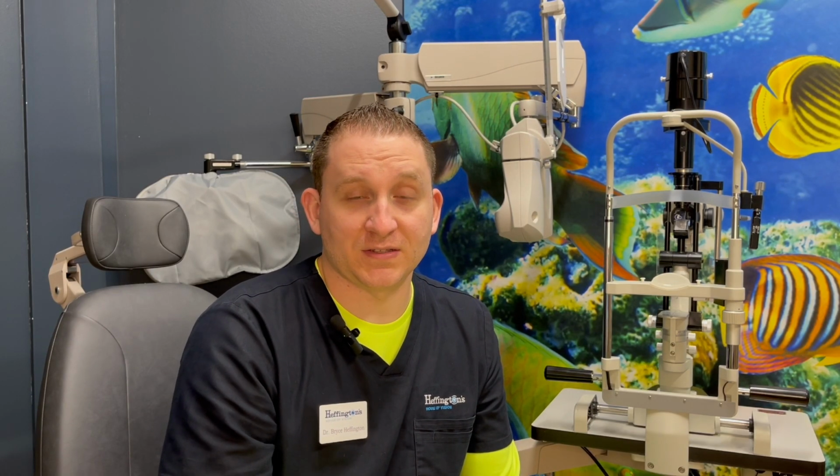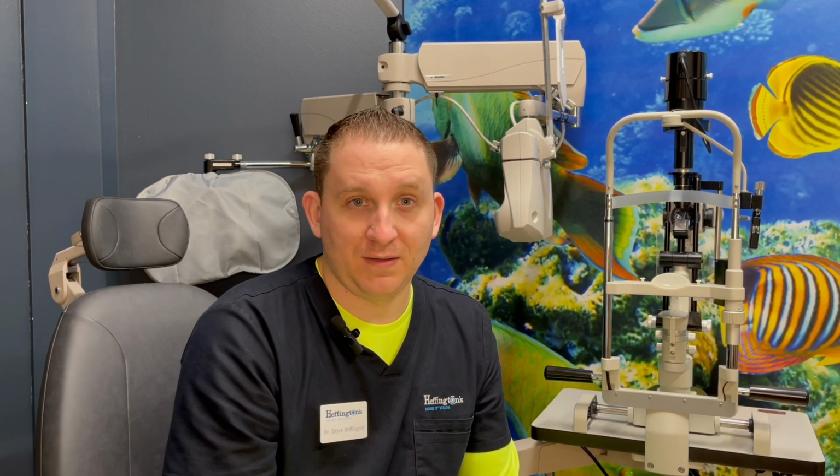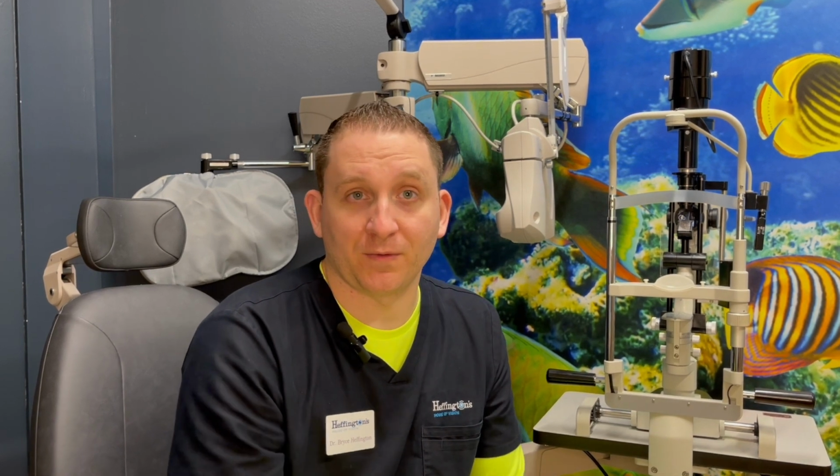And there's a lot of conditions that we see with this. We can even see things like retinitis pigmentosa, macular degeneration, diabetic retinopathy, even a bunch of unusual conditions like Best disease or Coats or things of that nature. But that is what we like to refer to and discuss when we talk about fundus photography and how beneficial and useful and important it is in our examination processes.